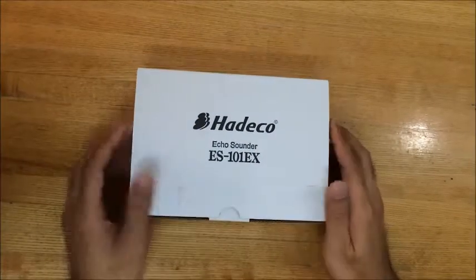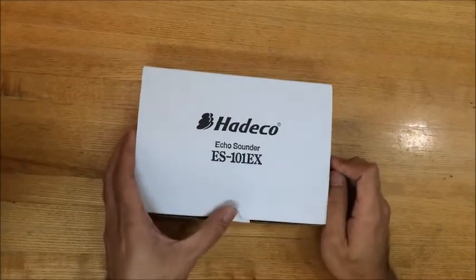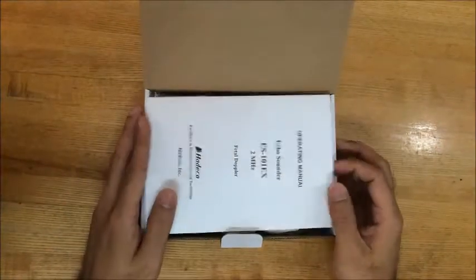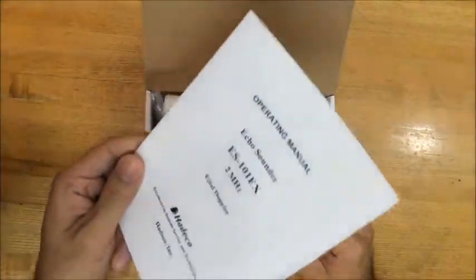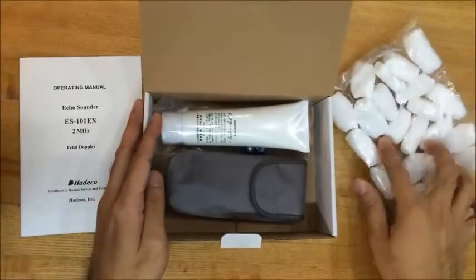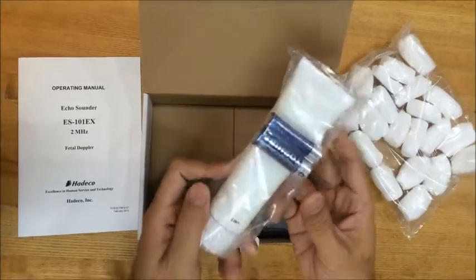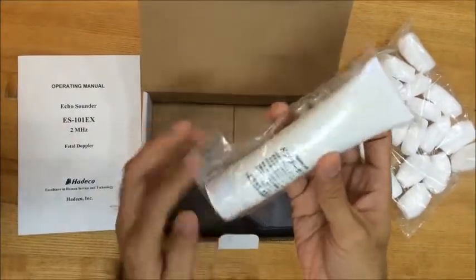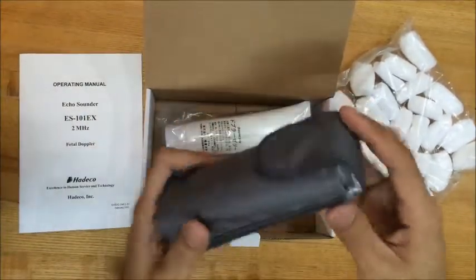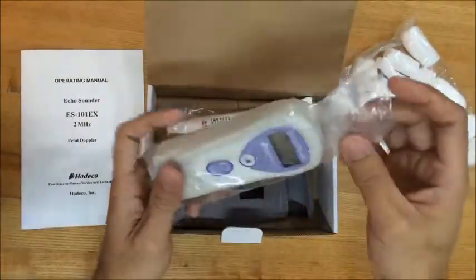Hi, we are going to unbox the Hadeco Ecosounder ES101EX. Inside the box is the operating manual. It has a Doppler Jelly and also two AA batteries. It also comes with this small bag, and inside is the Hadeco Ecosounder.